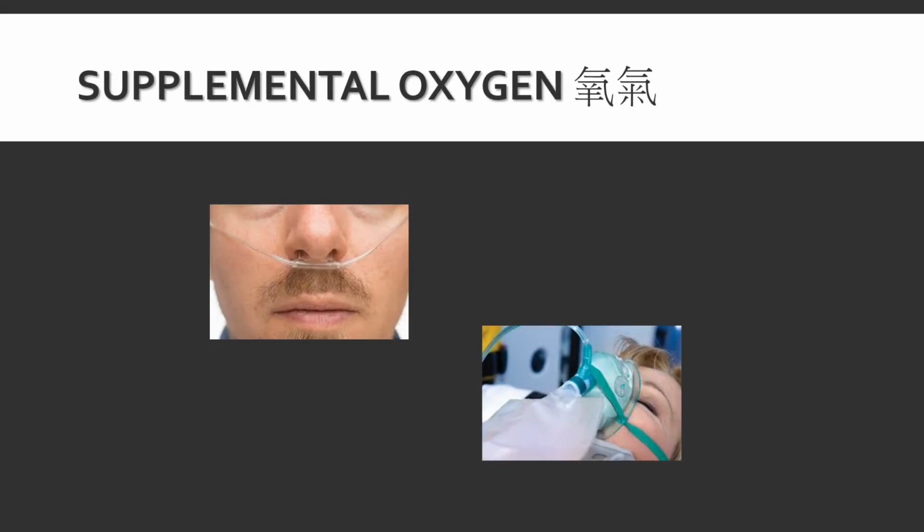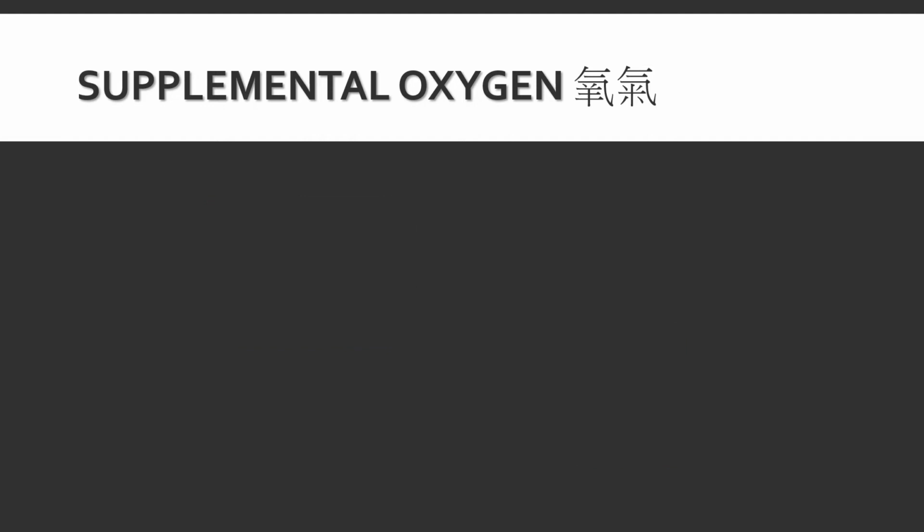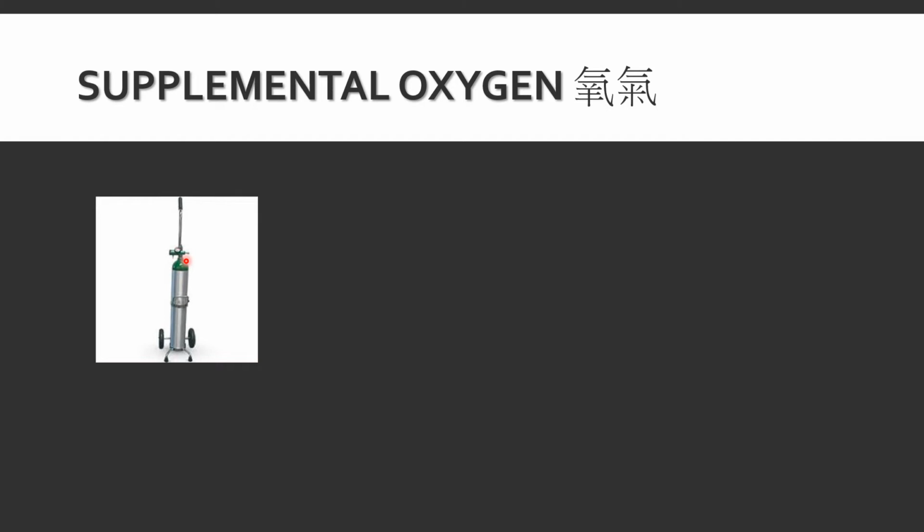The second technology, again, should be very familiar to most people. It is supplemental oxygen. If the patient requires some additional oxygen to function, we can deliver the oxygen either using a nasal cannula or a mask. Many patients with chronic lung diseases like COPD or lung cancer will require supplemental oxygen even when living at home. Supplying oxygen to patients used to be pretty inconvenient. We need a tank like this. When the oxygen is used up, we need a different tank. This tank is somewhat dangerous if we use oxygen at home. It increases the chance for fire, and it also increases the chance for an explosion.